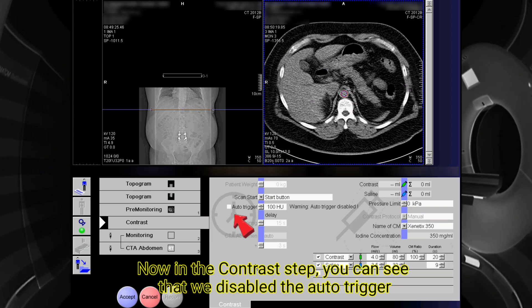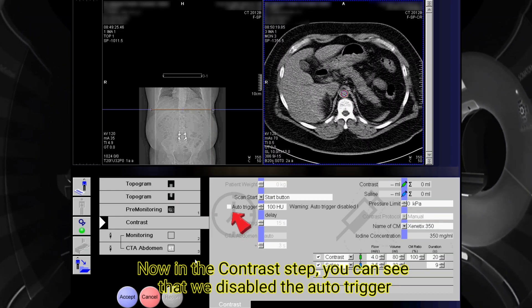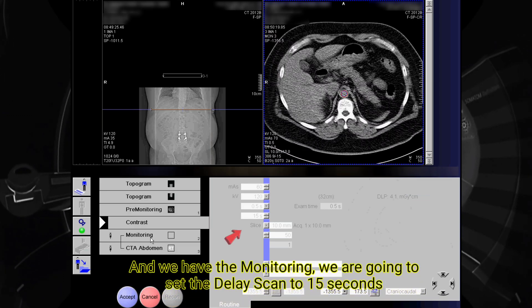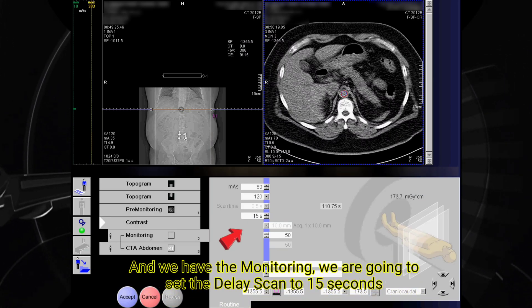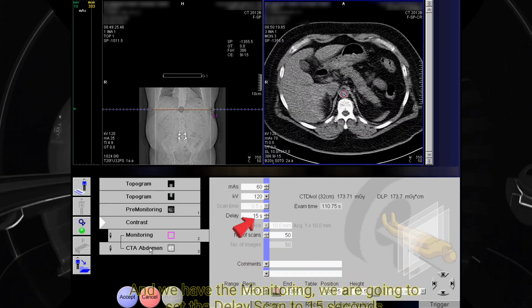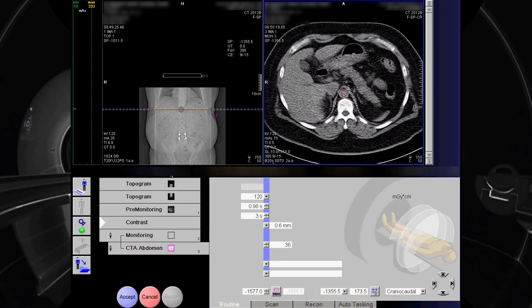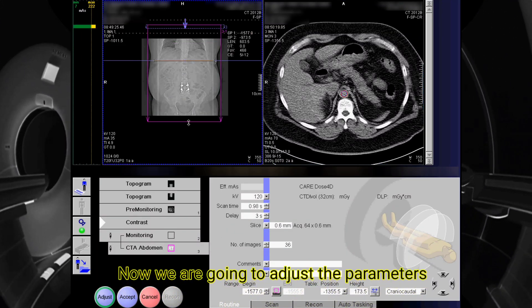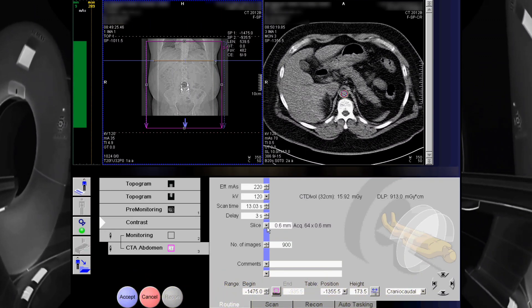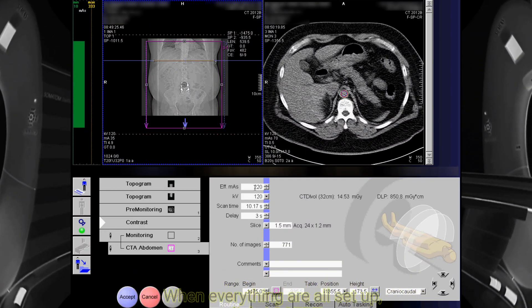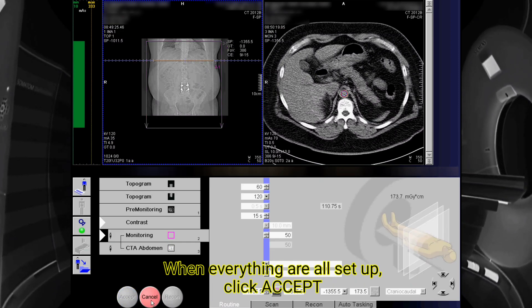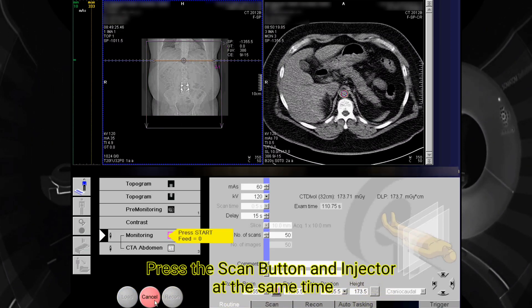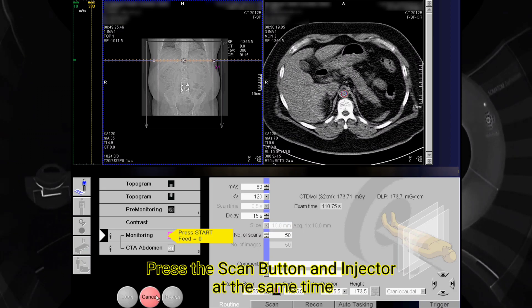Now in the contrast step, you can see that we disabled the auto trigger. We have the monitoring, and we are going to set the delay scan to 15 seconds. Now we are going to adjust the parameters. When everything is all set up, click accept. Press the scan button and injector at the same time.